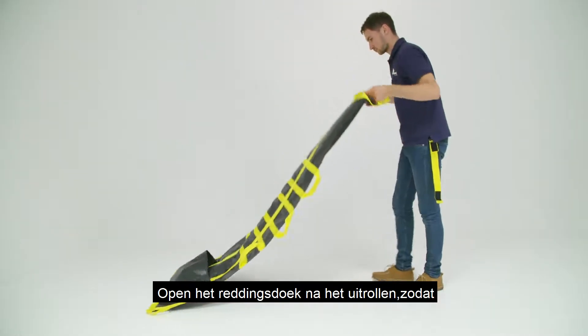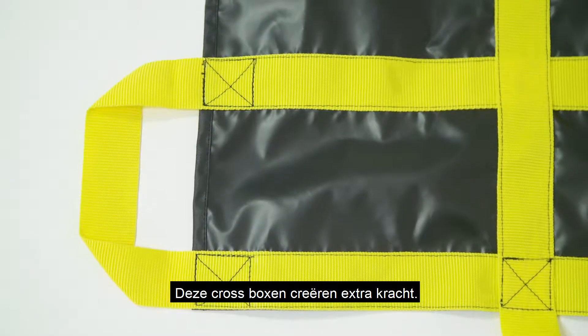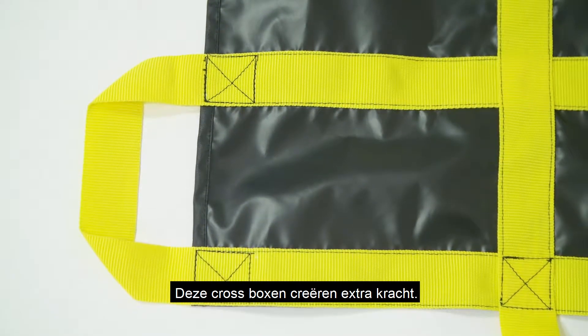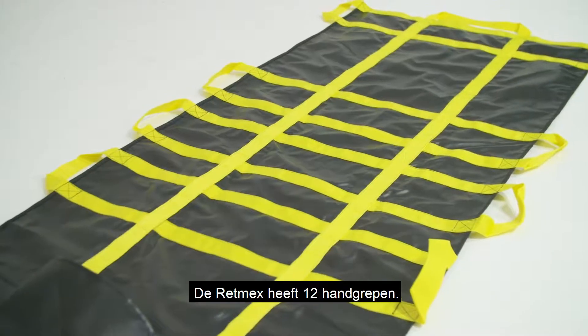After unrolling, you open it up so you can place a victim onto the rescue sheet. These crossboxes are placed to create extra strength. The foot sack ensures extra stability.